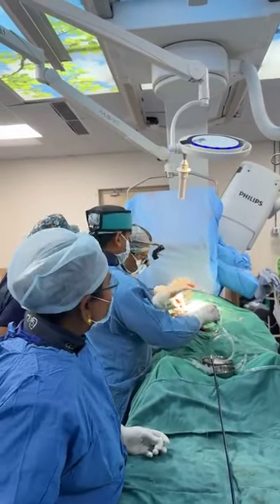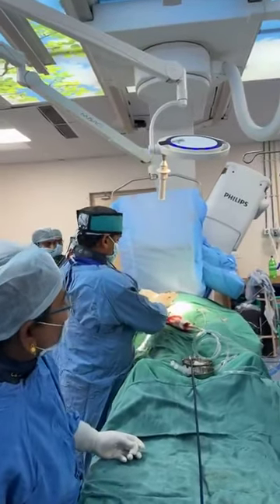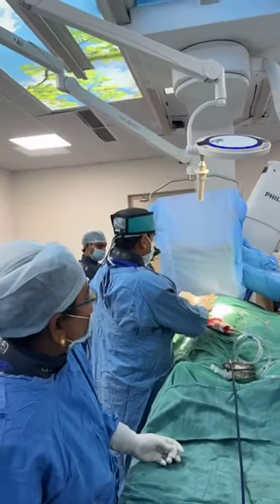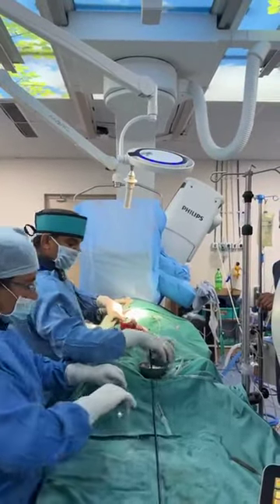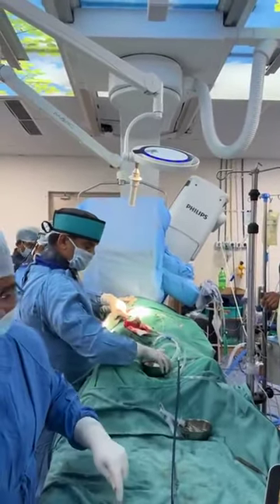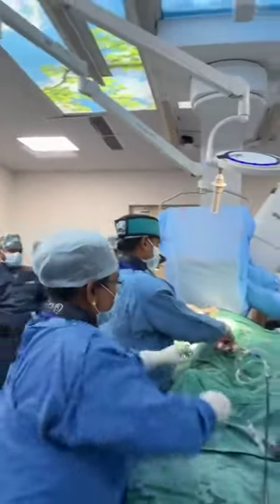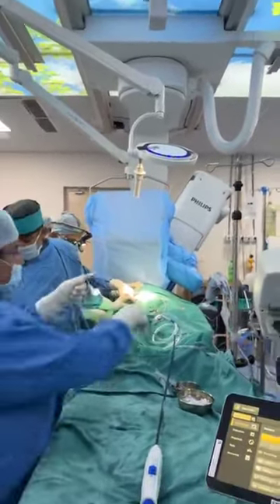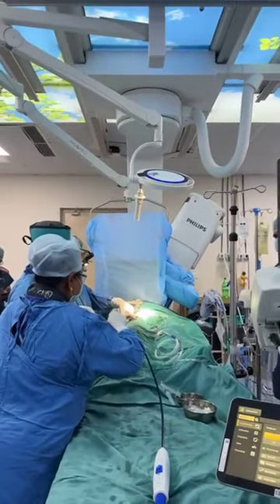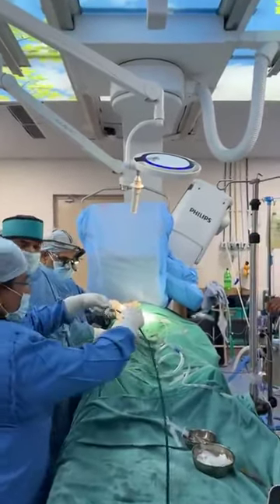Okay, now we can remove. Okay. Remove. Sorry. Keep it away, it will become bloody. Okay, bhai, holding. Can we have the graft going in? That's perfect. That's well. Very careful about it.